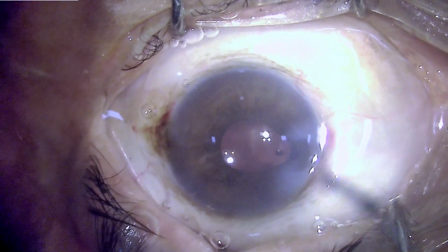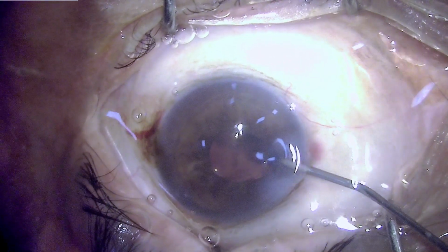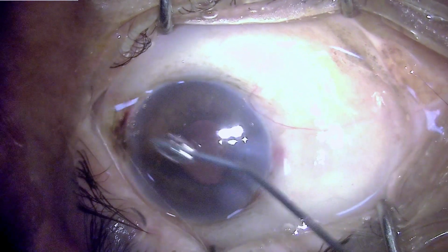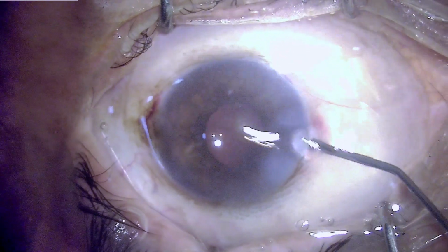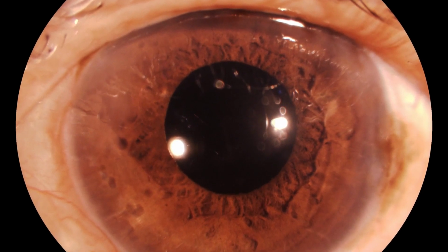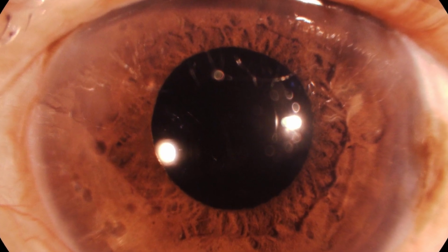The surgery has been finished, and now hydrating the wound, and before that one has to take care that the chamber is deflated, the iris is reposited, and then only one should attempt to inflate the anterior chamber because the iris may flow out. This is the first day post-op picture, and as we can appreciate, the cornea is exceptionally clear and the patient also had good visual gain.